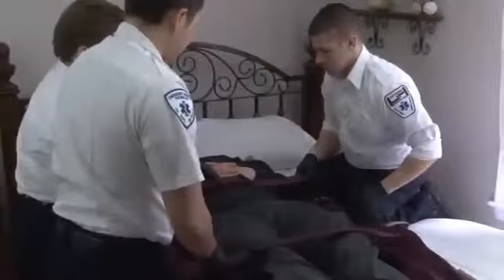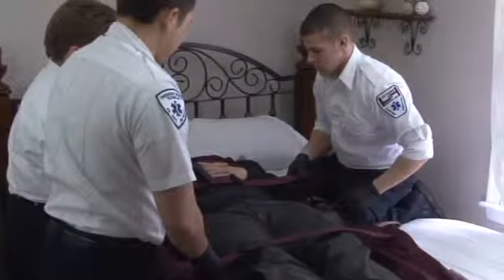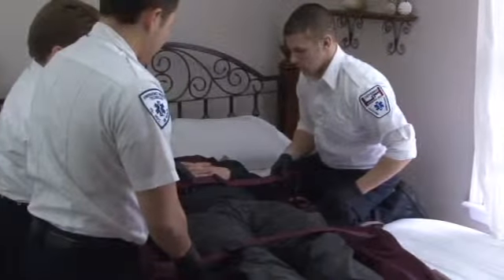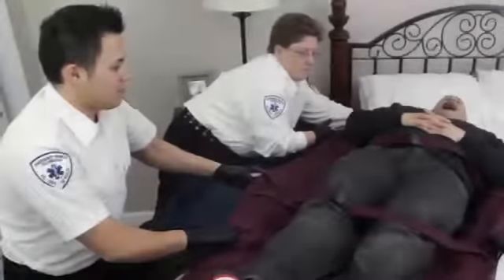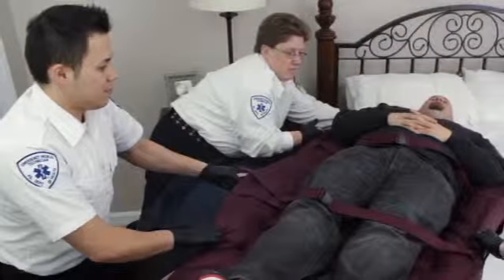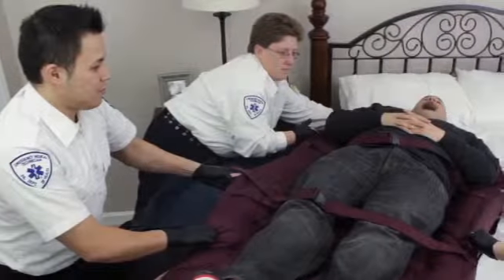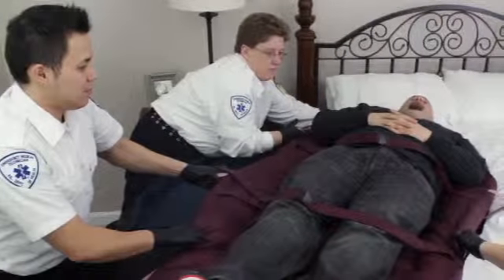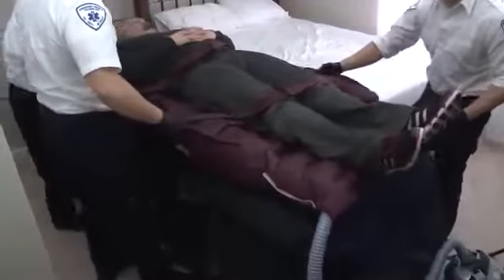The crew member on the patient side will initiate the transfer by pushing the HoverMatt onto the Evacuation HoverJack 2 at an angle, either feet or head first. The crew member on the opposite side receives the patient by grasping the handle and pulling the HoverMatt and the patient to complete the transfer. The receiving crew member should maintain an upright stance and wait for the handles to be within reach to assist. One crew member will make sure the patient is centered on the Evacuation HoverJack 2 before instructing the crew member at the foot end to turn off the air supply.